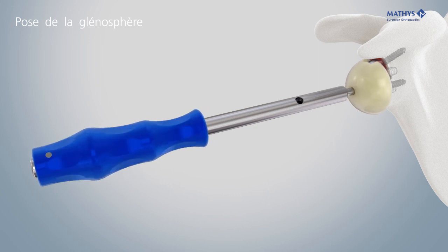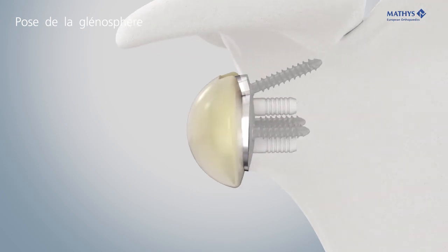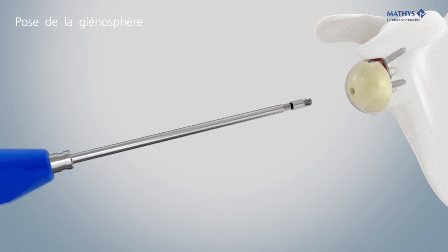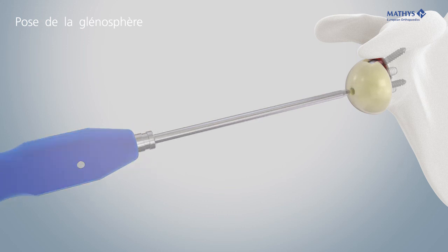Check the complete connection between glenosphere and metaglene. The superior cutoff of the glenosphere needs to be flush with the metaglene. Finally, screw in the fixation screw to secure the glenosphere.